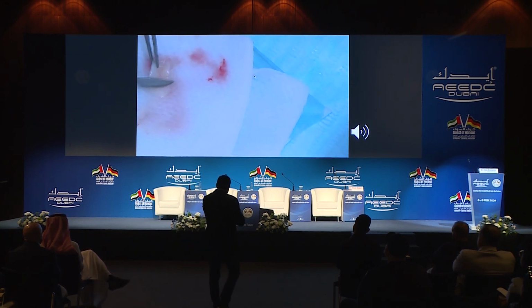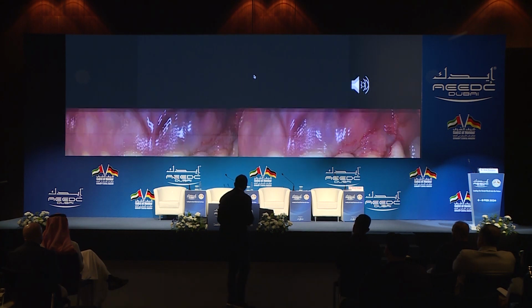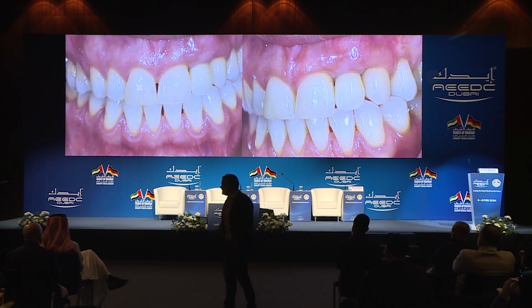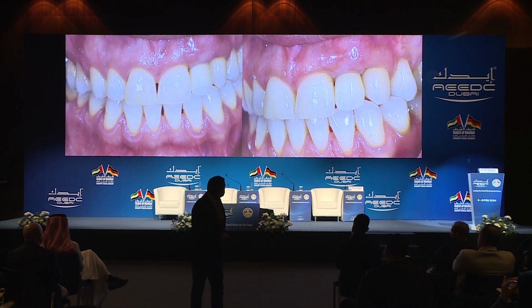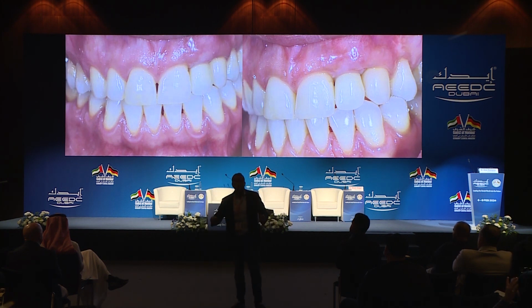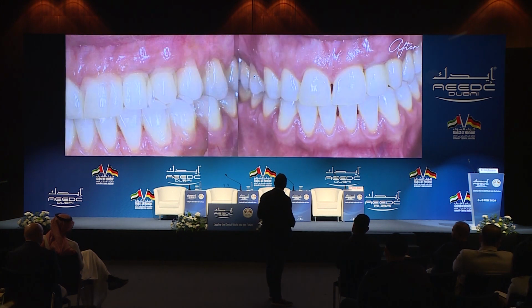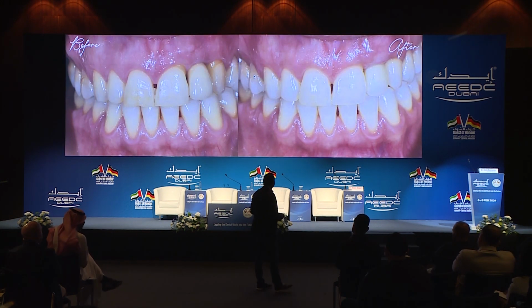So this is after we take the connective tissue graft, we go forward, place temporary cemented on the adjacent teeth away from the gingival margin, and then 6 months after we start the remodeling phase. 6 months after, she was happy with the result. She didn't want to go. She felt I was Superman because in 1 time surgery, didn't have to do the touch-up. So lucky me, I was really super lucky in this case. And this is the case before or after.